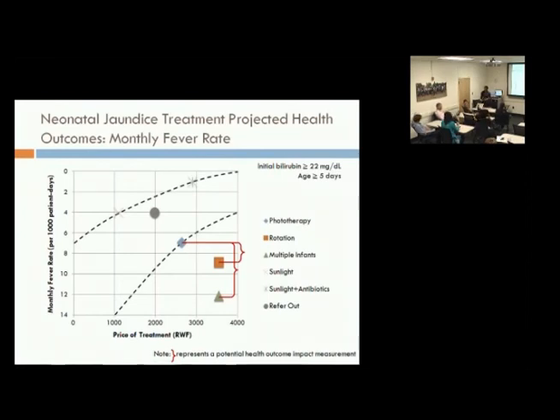Right. And so part of that is, when I was doing the equipment survey and I was asking how many phototherapy lamps do you have, one of the questions we ask is, essentially, is this equipment breaking down and are you repairing and maintaining it? So obviously, in some cases, that's in fact why we rejected certain pieces of equipment, because they were not being repaired, and therefore it would not impact this question. But yes, functioning equipment versus availability of equipment will be something that will need to be taken into consideration. So we'd have to look for cases where the BMET is actually repairing the equipment.